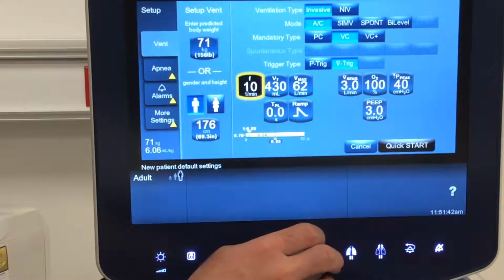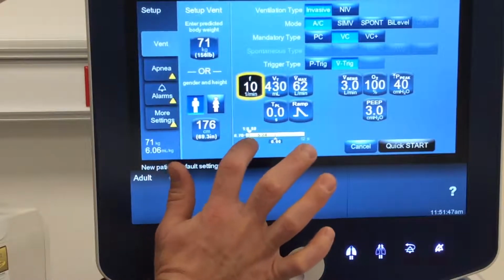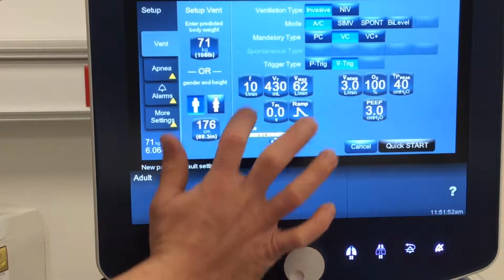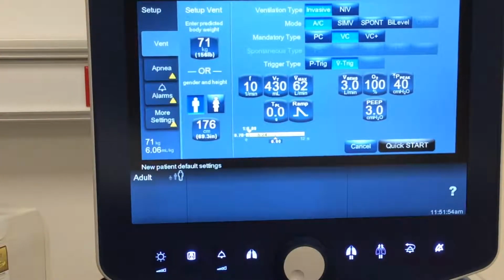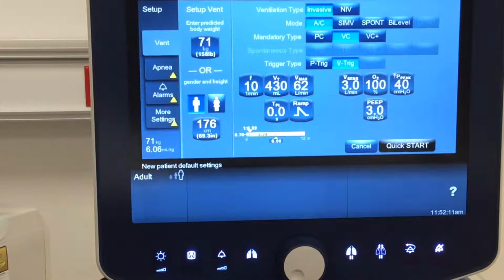So by me changing my respiratory rate, or let's just stick with what I got here for right now, it shows me some important pieces of information. This green piece down here, this little green line, that 0.76 is our set inspiratory time. So in lecture component, we'll get into the fact that we're actually directly fixing inspiratory time in assist control. All breaths are effectively kind of time cycled, okay? So it's important that we actually deliver that breath over an appropriate period of time. We want that breath to get in a timely manner, but we need to keep it down there long enough for sufficient gas exchange to take place.